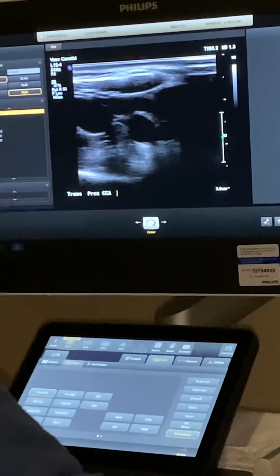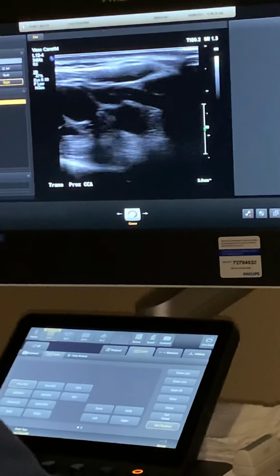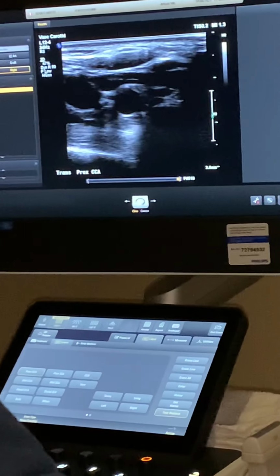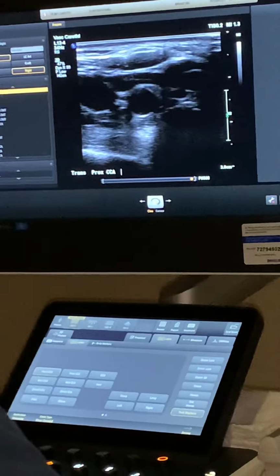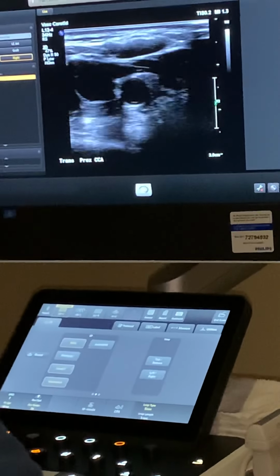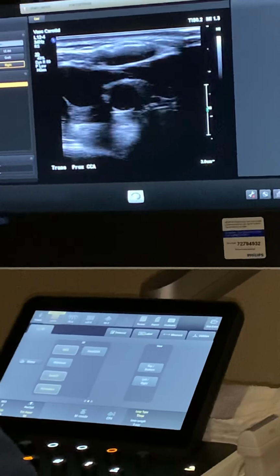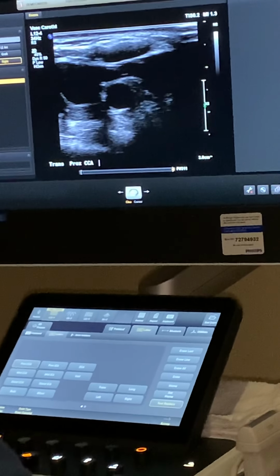Oh, look, I can see it coming straight off your brachiocephalic. That's fantastic. Right, this is trans prox common carotid. We're going to be able to see all of the edges of your vessel, clear out your lumen, center of your screen. Picture.